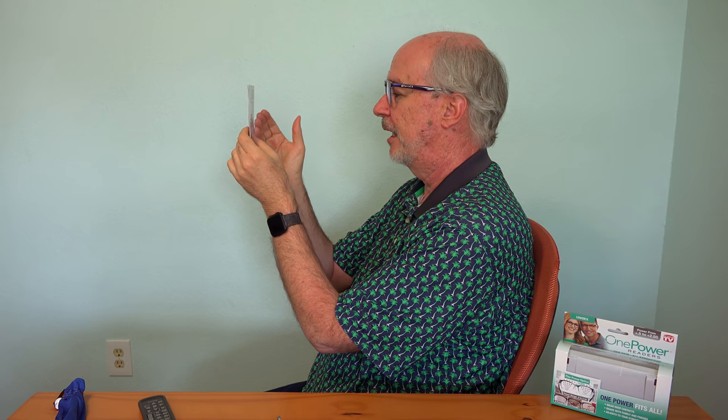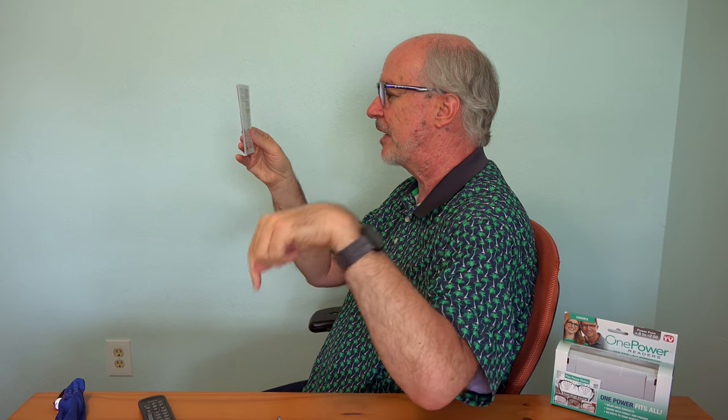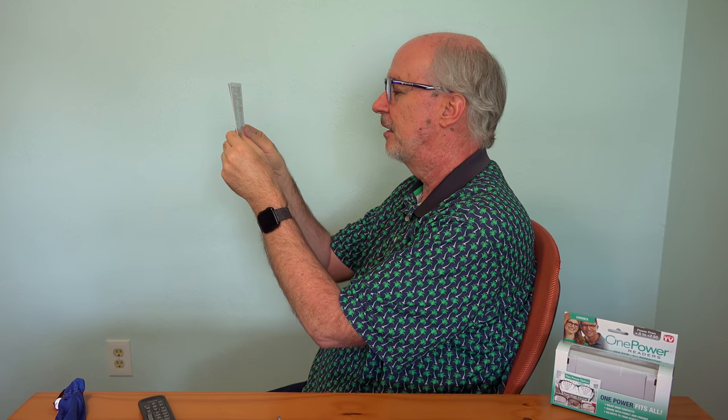Comparing them to my prescription glasses — it shouldn't matter where I look. Let's go for close first: blurry, blurry, yep, blurry. Okay, I am in focus here at about eight inches — about the same as the center of those glasses. Focus holds, then getting blurry again. Yeah, it's pretty close to the center zone of these glasses.